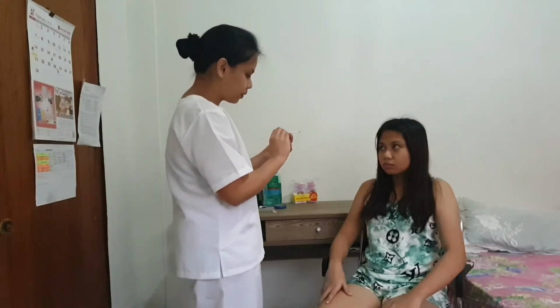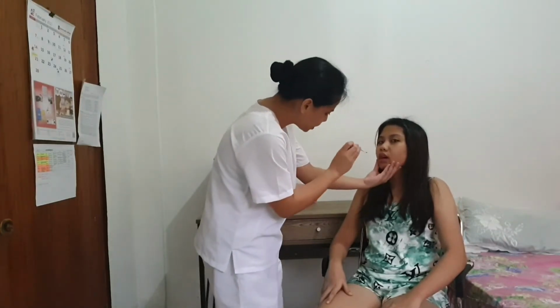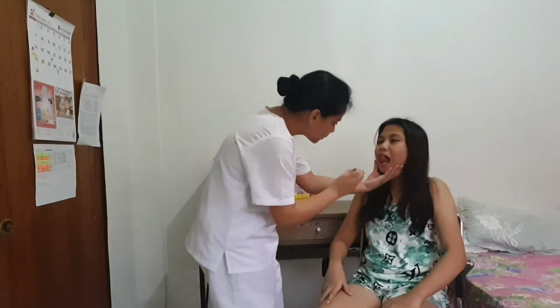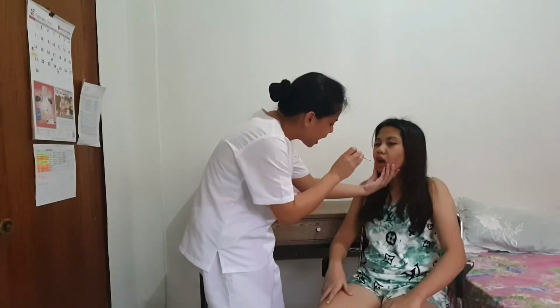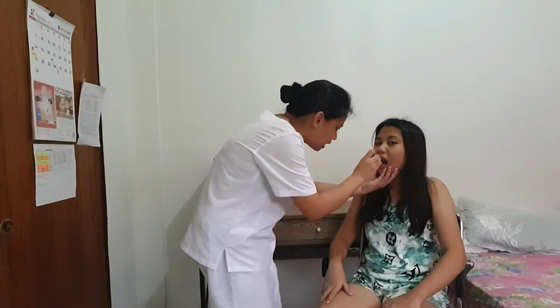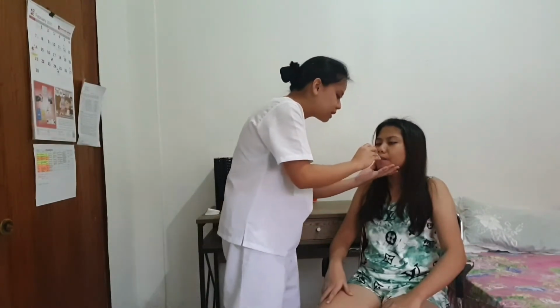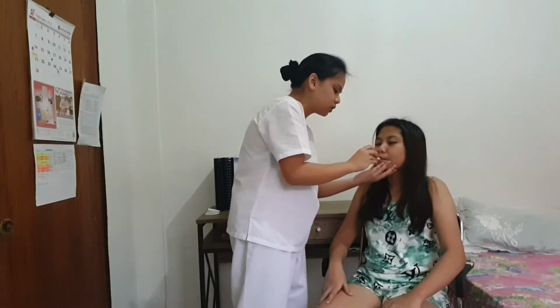Okay, ma'am. Please open your mouth. I'm going to put it under your tongue. Please widen your mouth. No, don't do your tongue like that. Just put it higher. Open your mouth bigger. I'm going to place it here. Close your mouth, please. Okay, thank you so much.